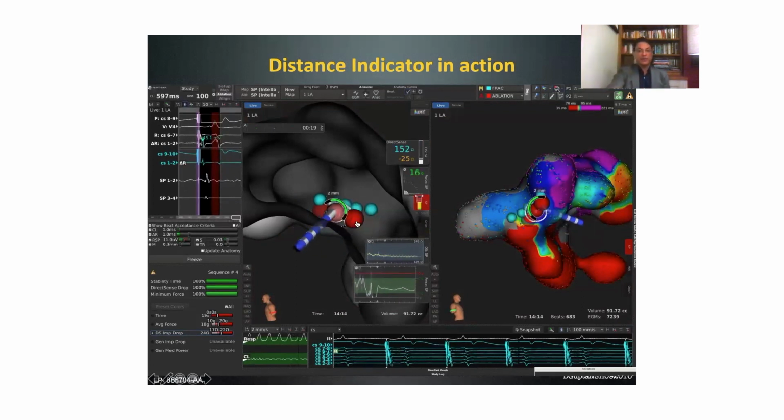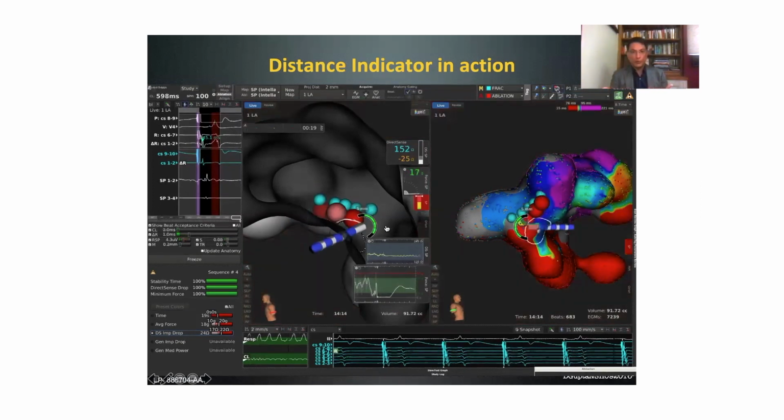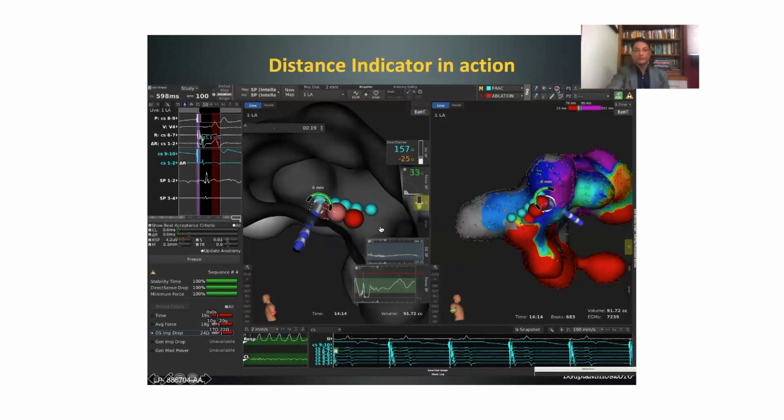So look at this here. For example, I started off from this particular burn. It was measuring off this AutoTag, but now it's measuring it off this AutoTag. And as I move the catheter further, it will then start working off this AutoTag. And I find that quite useful because that's all you're really interested in: how close you are to an RF lesion that you've delivered in the immediate vicinity, not necessarily where you delivered the last time around. So I find that quite useful.